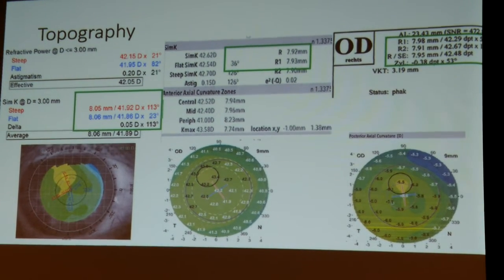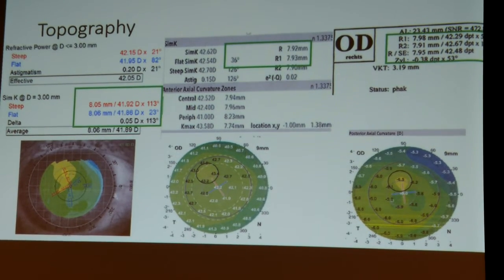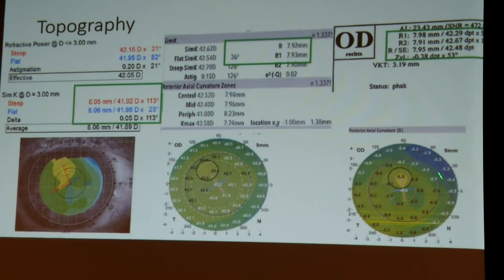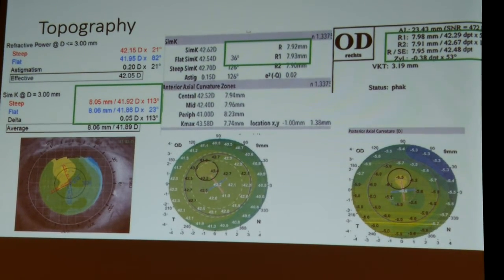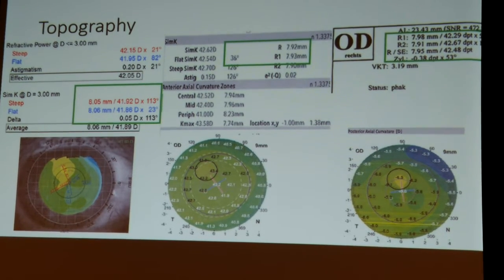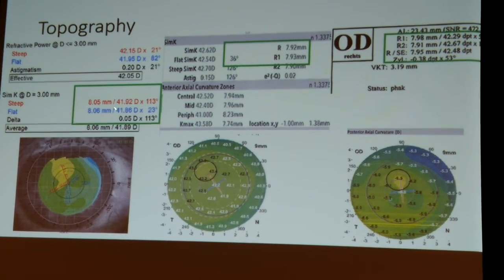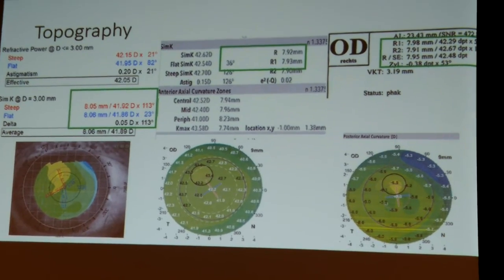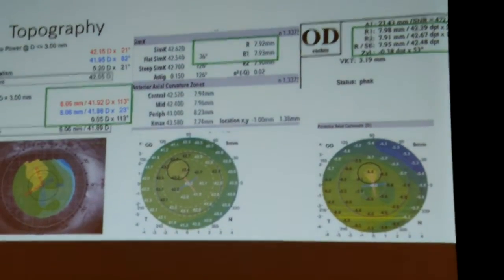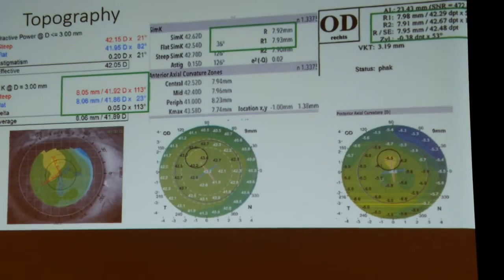With the topography, we use as well the iTrace and the Galilei. And the Galilei, because it's a placido disc dual Scheimpflug machine, also gives you quite a nice picture of the posterior cornea. And so we do a full setup for the cornea so that we are sure this is a regular cornea, not in any keratoconus or active problems. And then we use the readings, and we always work with millimeter scales, not diopters, because what we measure with the topography is a curvature, and the curvature is a radius, and the radius scale is a millimeter scale. So we use millimeter scale so that we are not prone to make any mistakes with the indices. So that's just how we do it. If you have a better idea, just let me know.